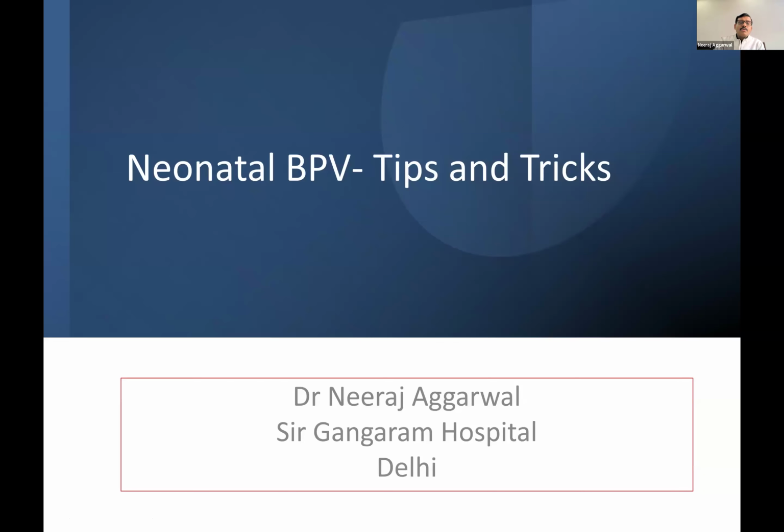So, today I will be talking about a cath lab procedure which is commonly done in all the cath labs. Balloon pulmonary valvuloplasty for the newborns. I will try to share my experience and how to manage difficult situations. Let us try and understand the tricks and tips of neonatal BPV.